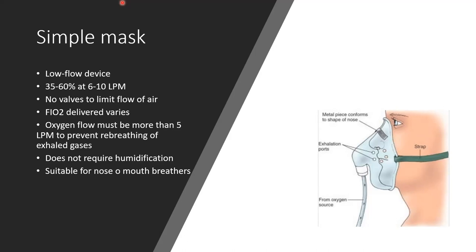So I go to the patient's room and I assess the patient, and I notice that the oxygen is at 2 liters per minute, but the patient was on a face mask. And I said, "This could not be. When I made my rounds at lunchtime, the patient was on a nasal cannula, and now I've discovered this patient to be on a face mask with a flow rate of 2 liters per minute." So I said, "Who changed this device?" And she said, "Oh, I asked the nursing assistant to change it because he has been complaining of his nose being so sore. And therefore, this is the reason why the patient is very sleepy."